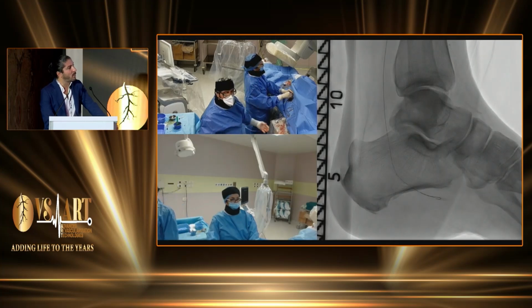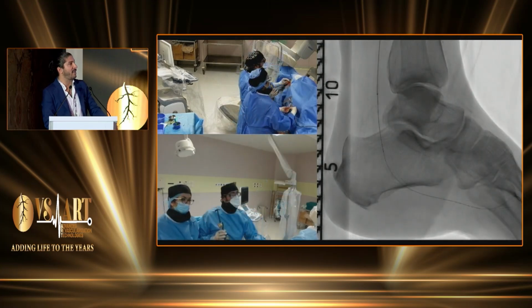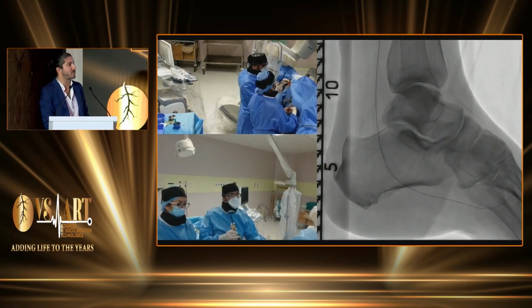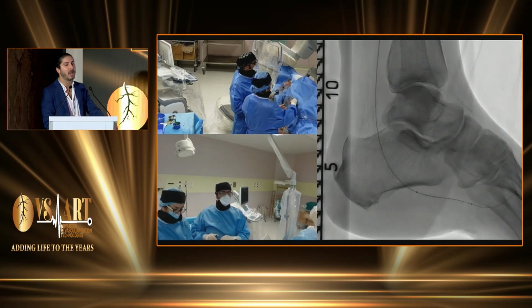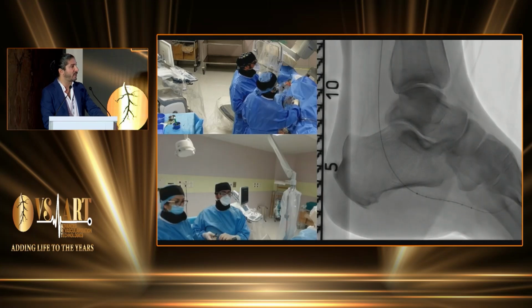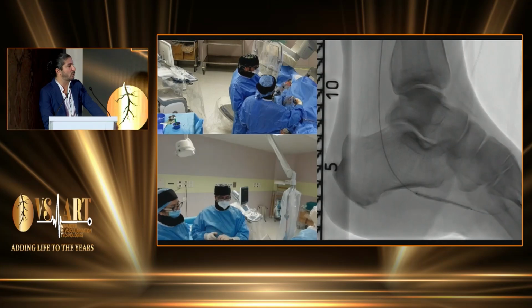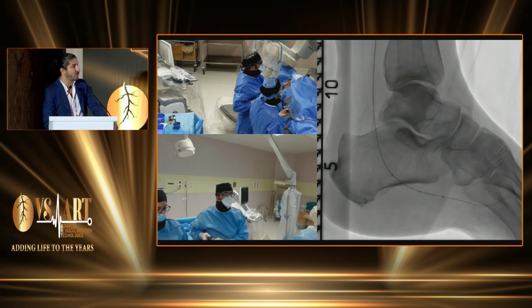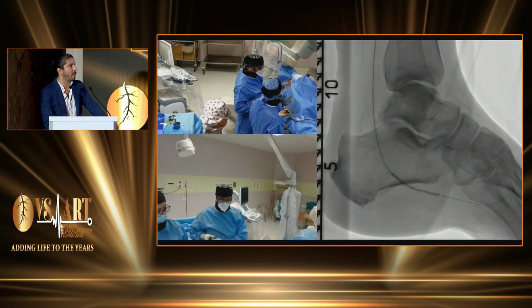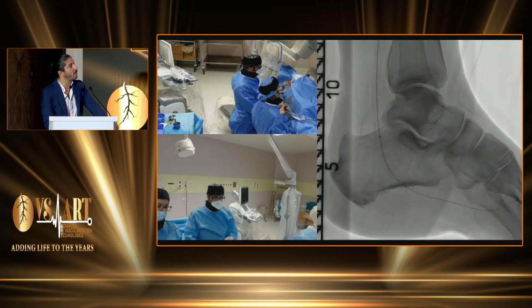and one of the biggest problems with the technology today, talking about below the knee and below the ankle, is to realize if the devices are able to cross. So this is a 2.5 Shockwave catheter after a 6 French long sheath in popliteal artery, no predilatation. The device was pretty well able to arrive almost till the arch. We were able to treat all the subocclusions in the lateral plantar as well as in the posterior tibial, multiple dilatations, and the main idea is to be able to repeat at least twice in the same place to be sure to crack pretty well the calcium.